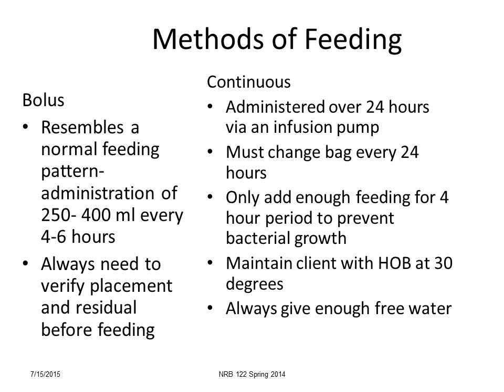There's two main types of feeding, and in class we're going to demonstrate these, but a bolus feeding is typically how we eat. Although it seems like for some people you may say to yourself, I've been eating all day. We really don't eat all day. So a bolus resembles a normal feeding pattern. Every 4 hours, every 6 hours, patients get a prescribed amount of liquid feeding. And you always have to assess for placement and residual before you give your feeding.